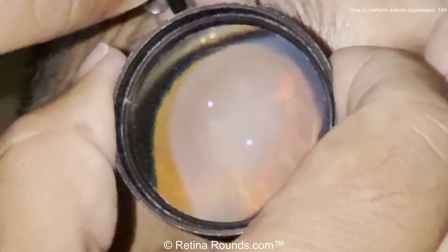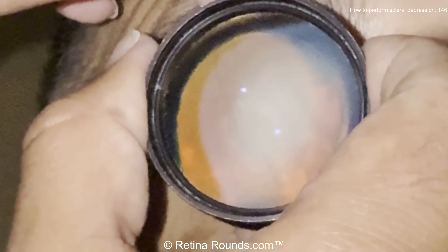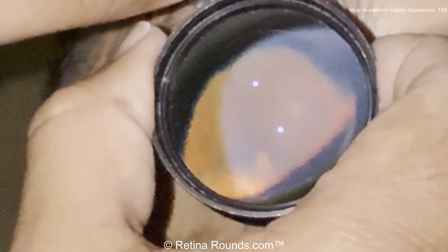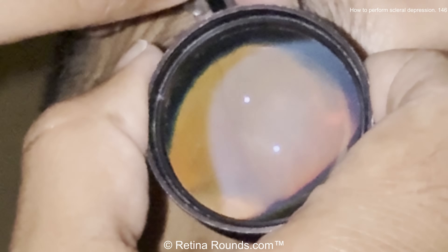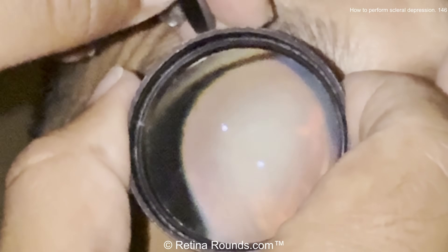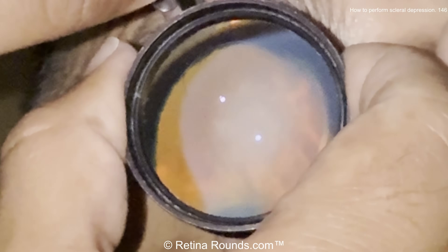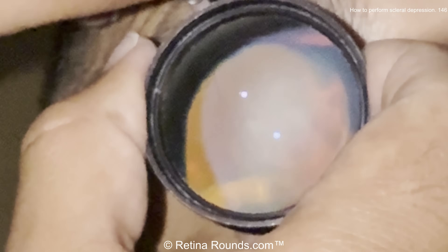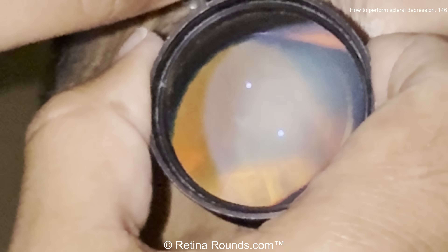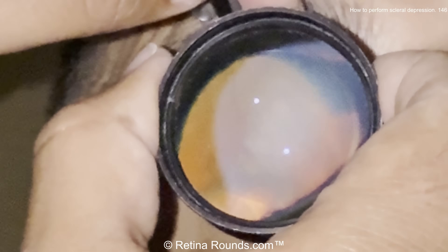Here's an example of what that view might look like. This is taken with the iPhone, so there is a little bit of degradation in image quality, but you can see that depressor there in the bottom part of the image — the elevated bump there of the depressor. That's just about at the level just posterior to the ora serrata. You can see the depressor moving posteriorly within the vitreous base, getting a good view of the retinal periphery. You can see the image of the retina, and as the depressor comes on, that bump from the scleral depression is right about at the level of the ora, just posterior to the ora.